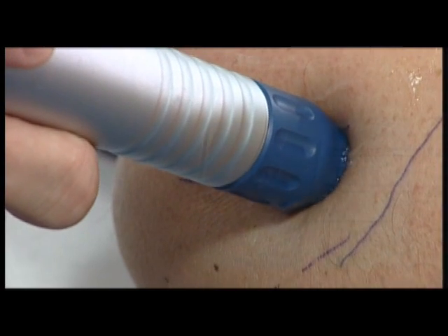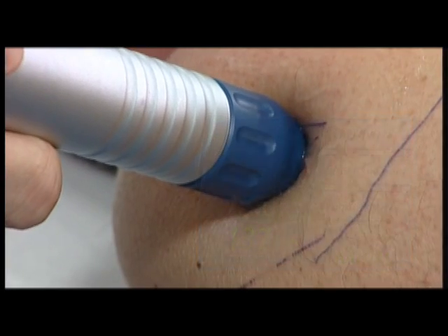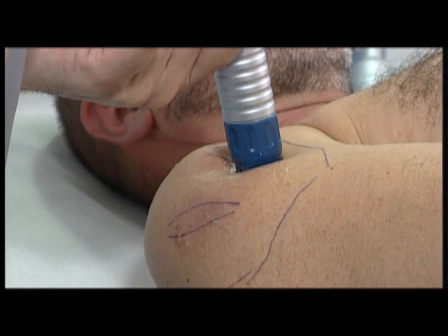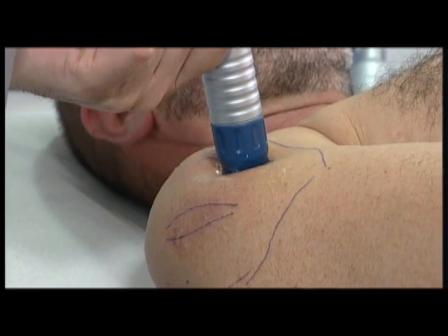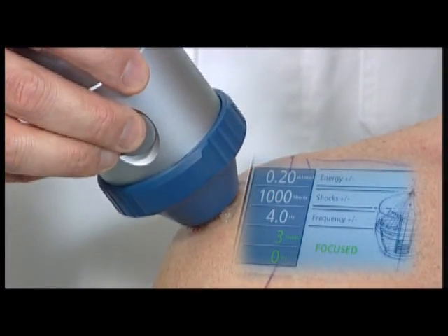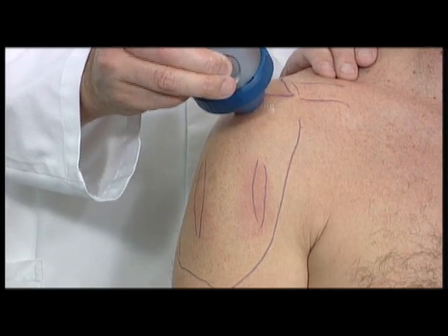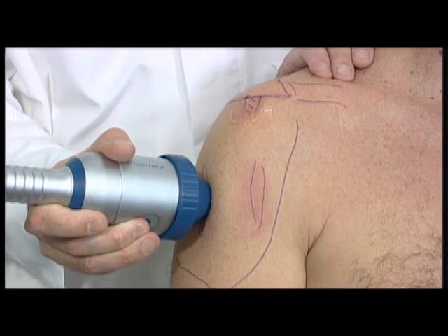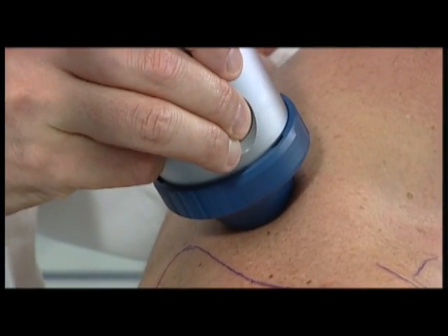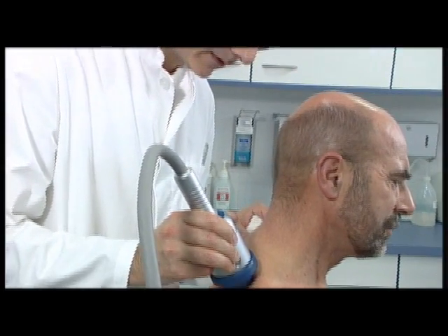The tense and hardened pain regions are treated by applying radial pressure waves over a large surface area. Muscles relax and lengthen, and the affected tissue softens. Trigger points are eliminated, in other words, inactivated. Deep-seated target areas can be reliably reached with the high-energy focused shock waves generated by the Duolith. The penetration depths achievable with these standard delay lines provide variable focal areas of 30 and 45 millimeters.